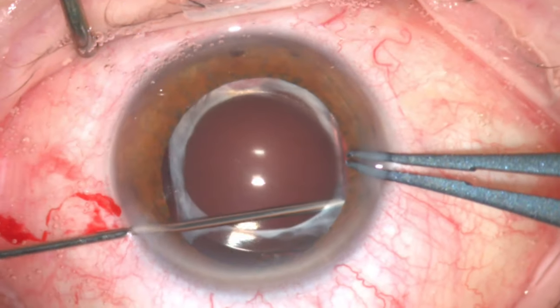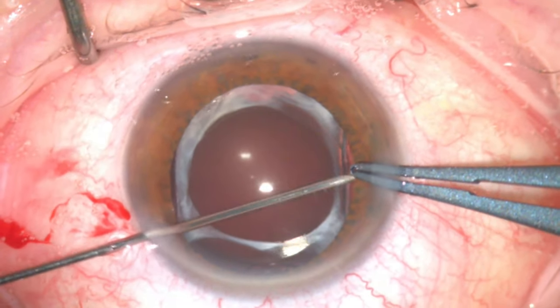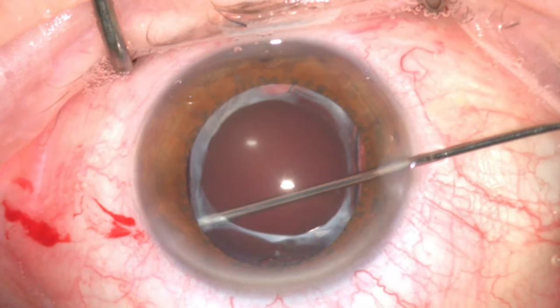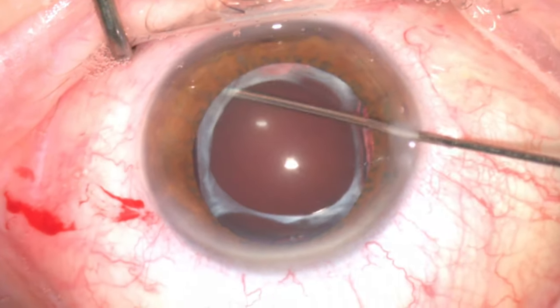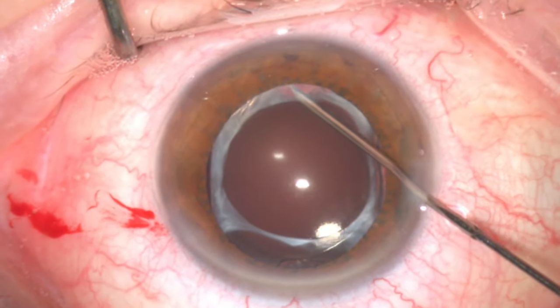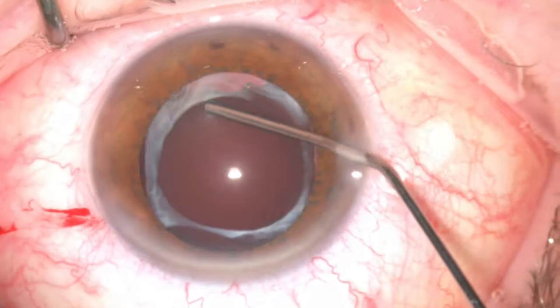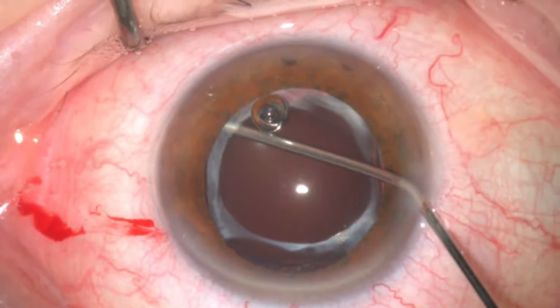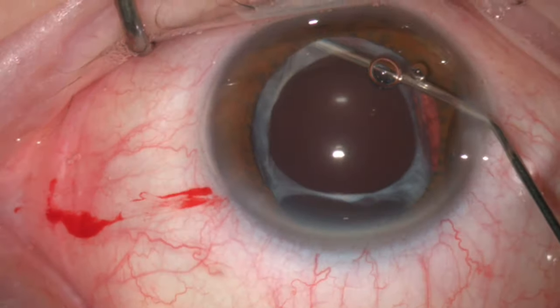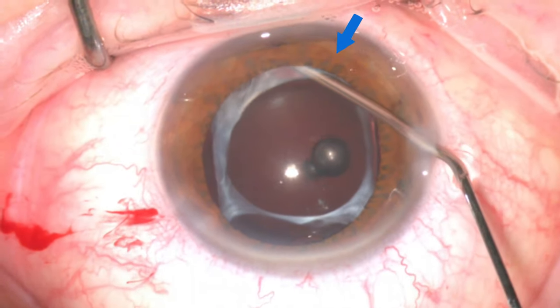There is evidence of severe zonular weakness and the capsular bag was unstable. It is essential to be delicate during the dissection to avoid further zonular damage. Further visco-dissection is injected in all directions to open up the fibrosed capsular bag around the optic and haptics of the lens. This step is further repeated using the dispersive visco-elastic cannula, which has a larger bore, until you see a good wave of visco-elastic going behind the lens implant.